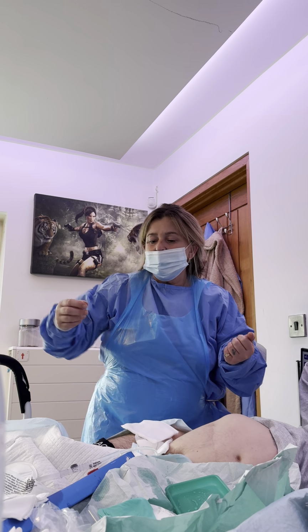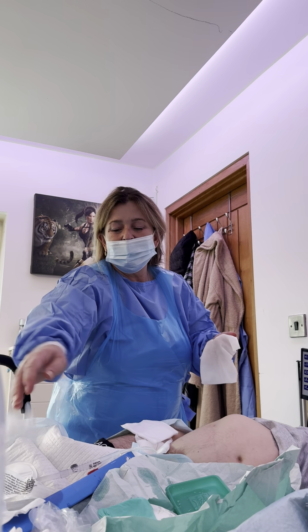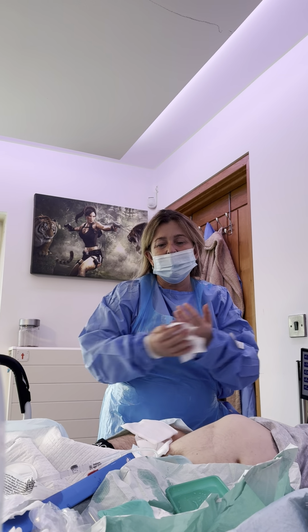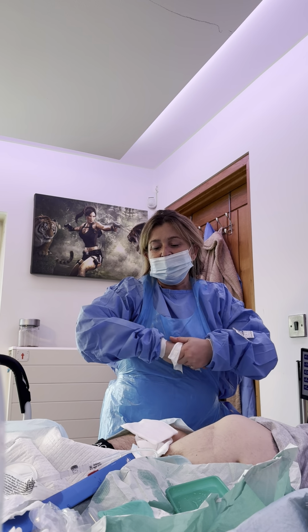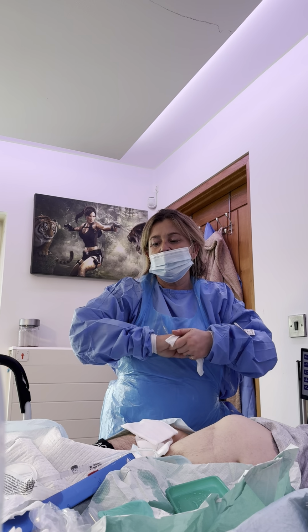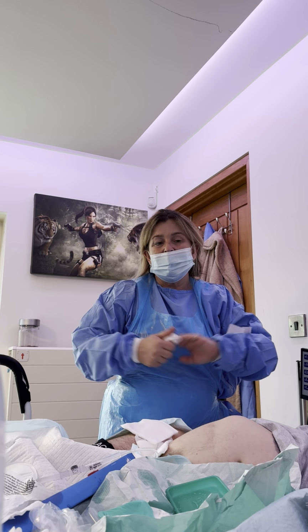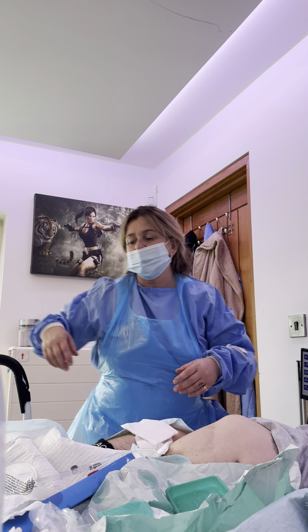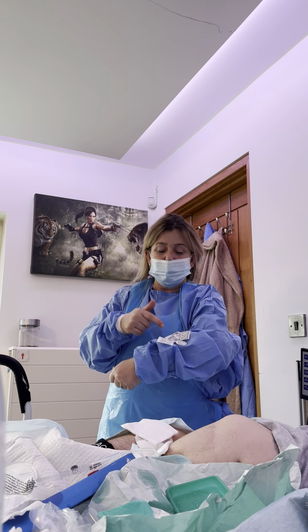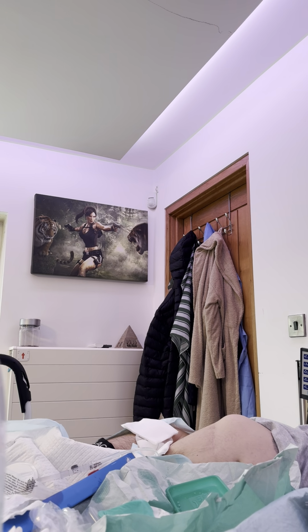So, yeah, this is what you call a quick suprapubic change, but I'm trying to do it as slowly as I can to show other people so that his staff in the future, when we have any issues, and I mean any issues, at least if I'm not around, they know exactly what to do with Ben. These are sterilised wipes. And I'll be phoning the company up in about 5 minutes to get that sorted. So yeah, always check your catheters.